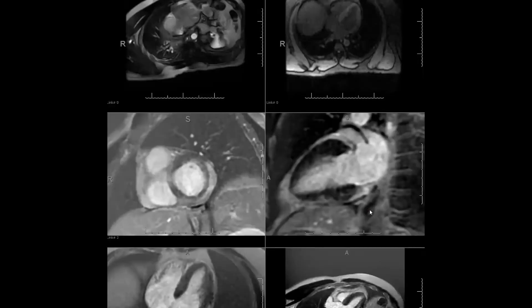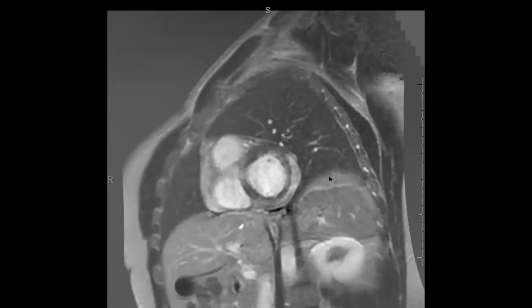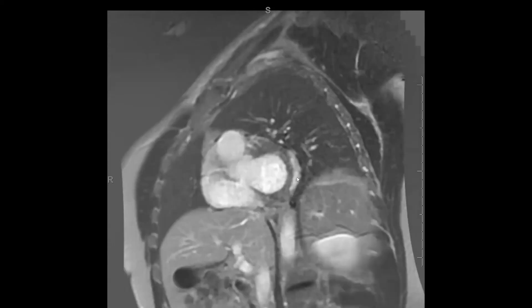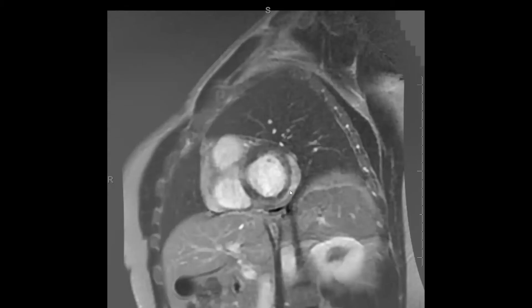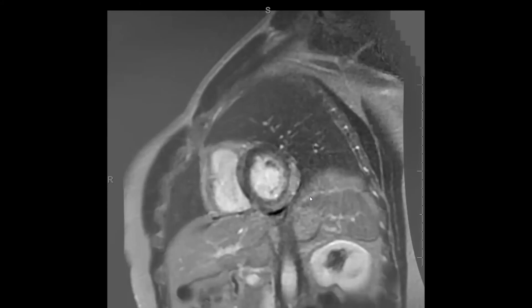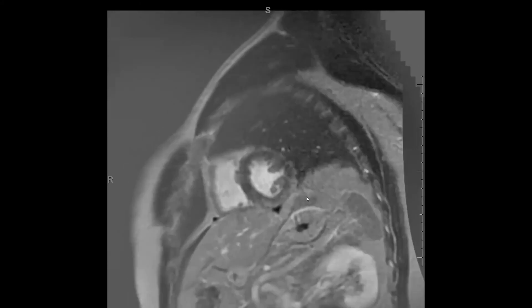Here are the delayed hyperenhancement images — short axis delayed hyperenhancement images after gadolinium contrast. In the same distribution where we saw abnormal T2 signal on STIR imaging, we see areas of abnormal delayed hyperenhancement within the subepicardial portion of the LV, again in the inferior wall, inferolateral wall, and lateral wall. Very abnormal.